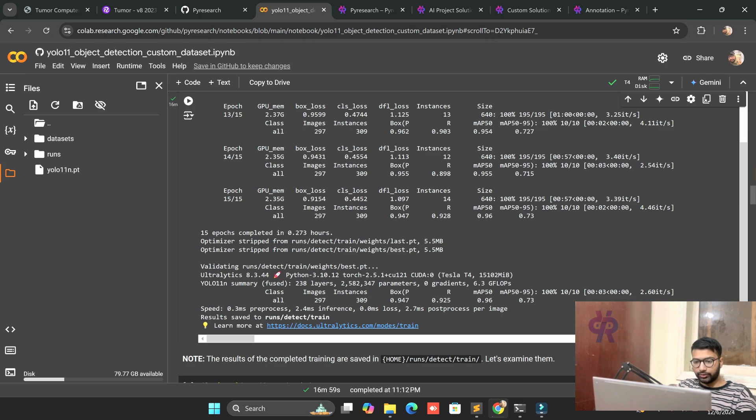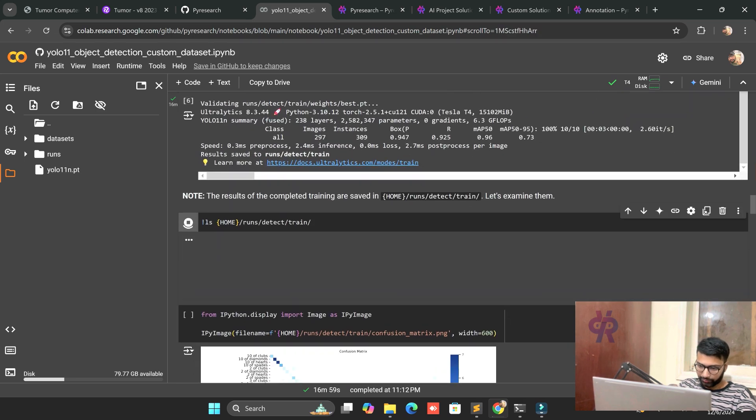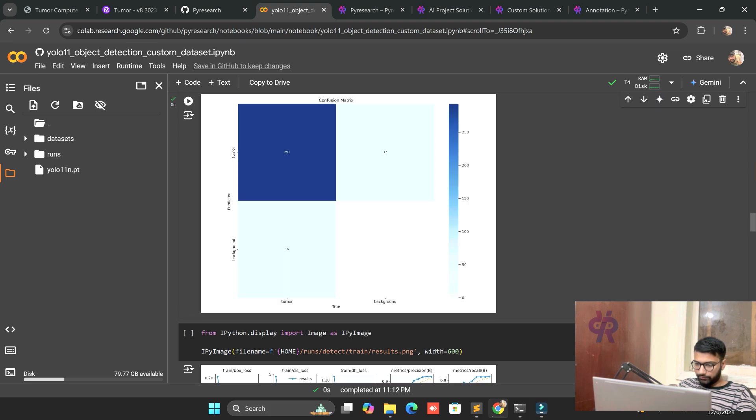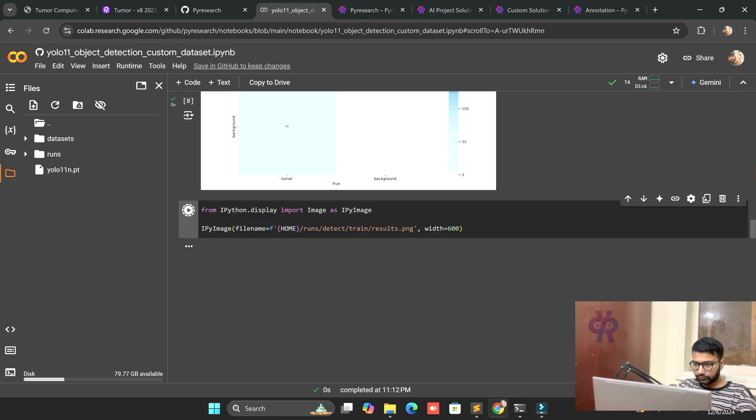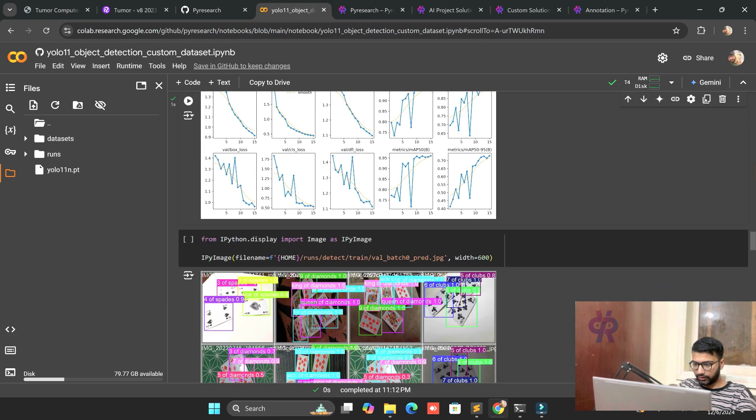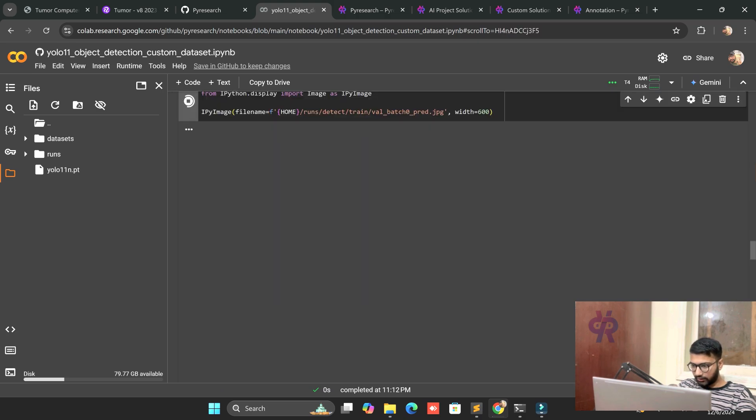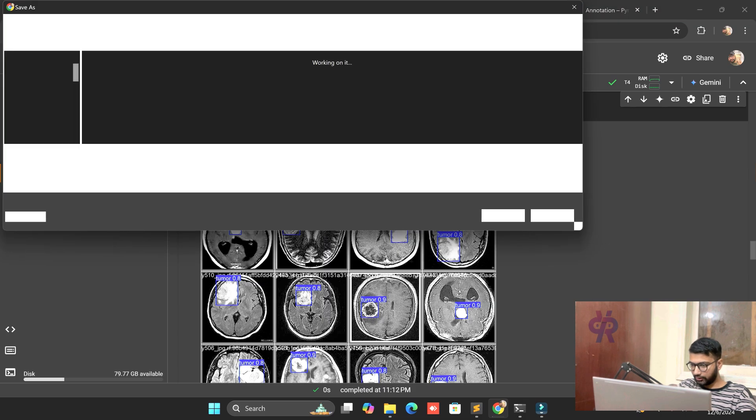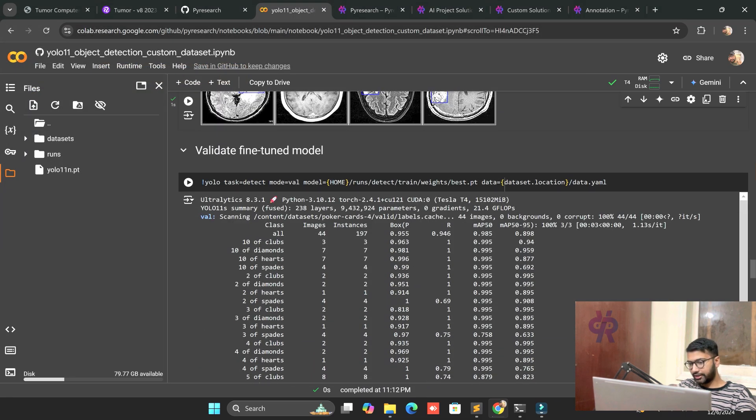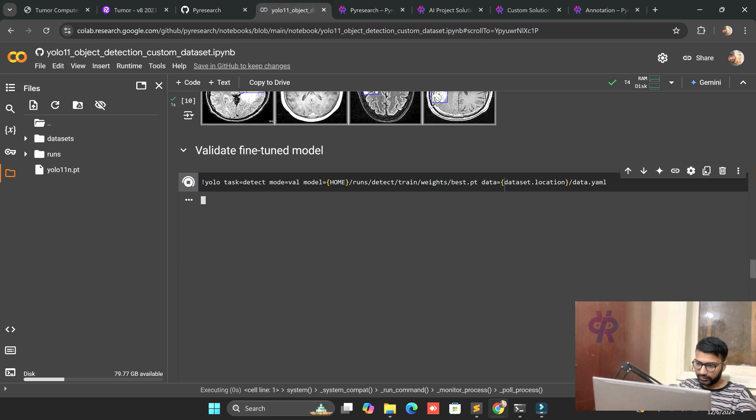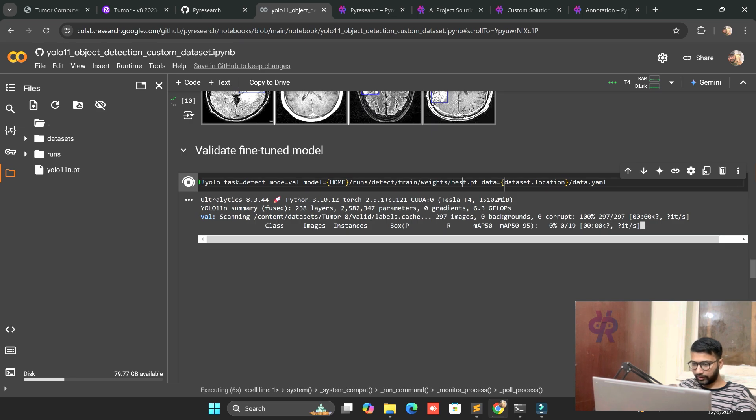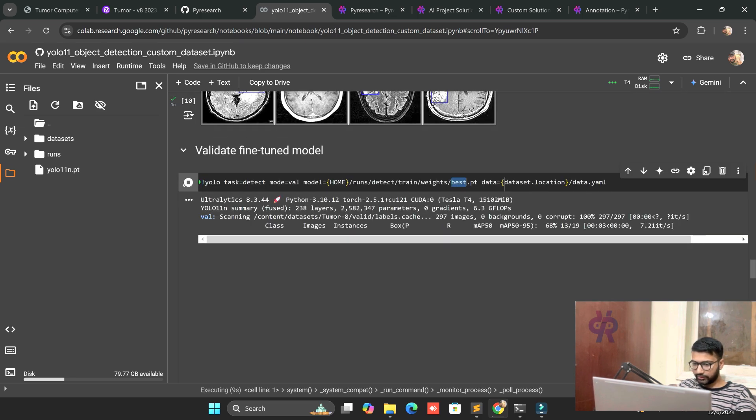You can see now we completed our epochs, 0.273 hours. Let's start calling the directories and folders. You can see the confusion matrix - obviously, we are detecting the tumor, only tumor. Now we call our results. Here you can see the batches of the tumor working very well. I have already fine-tuned this model. Validation part is very necessary.